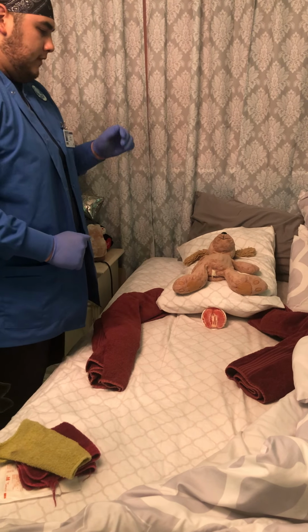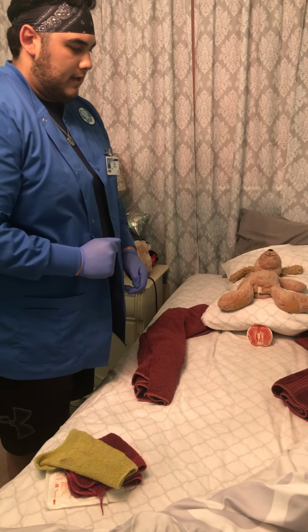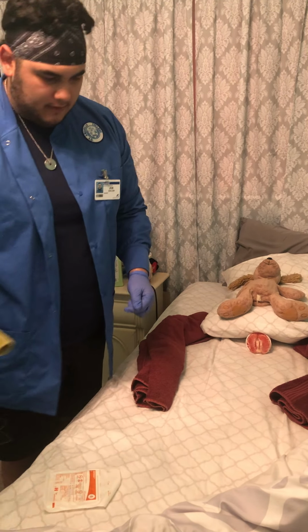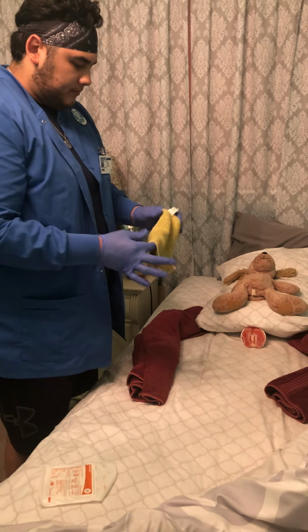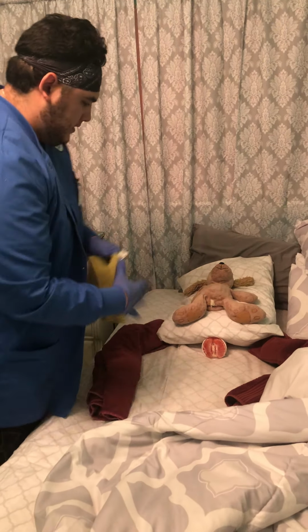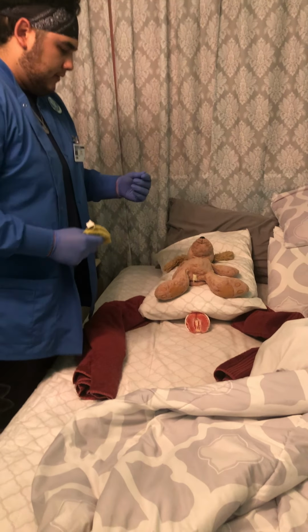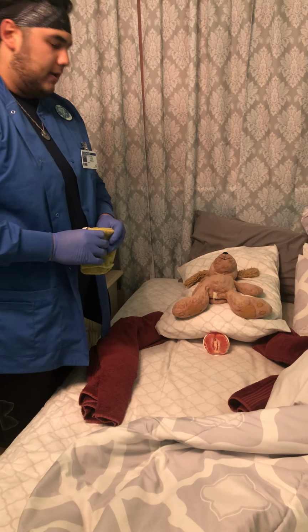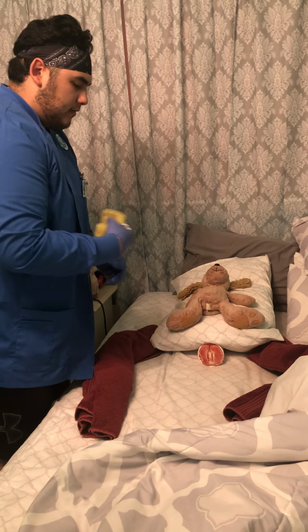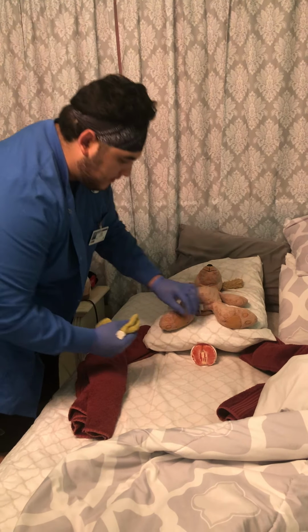And so after you've put the patient into that position, you're going to go ahead and clean the patient. So I've got a washcloth here with soap. And so when cleaning the patient's peri area, you want to start with the farthest side, and then you want to come over to the near side, and then down the middle.